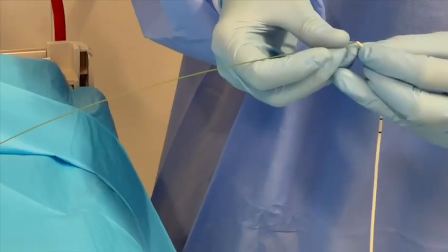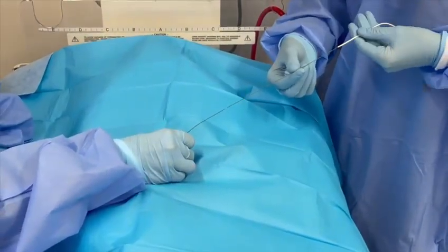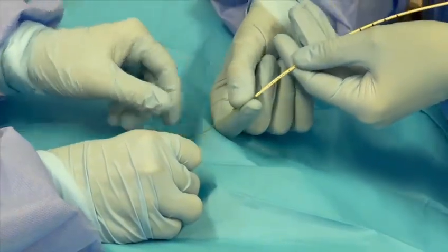Feed the pigtail catheter over the guide wire with the holes facing up. Advance to the first or second black line for a premature infant, 4th to 5th for a term infant. Then carefully remove the guide wire.